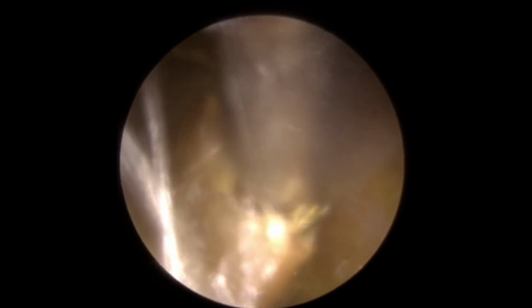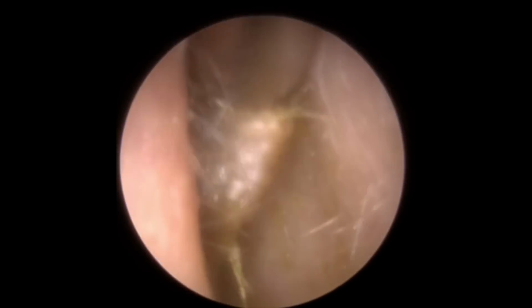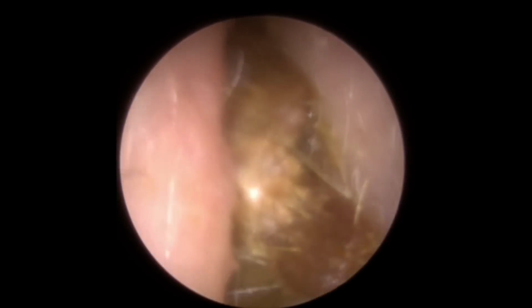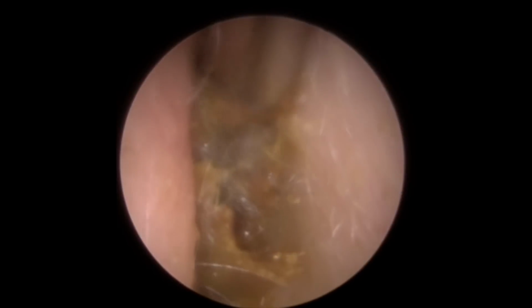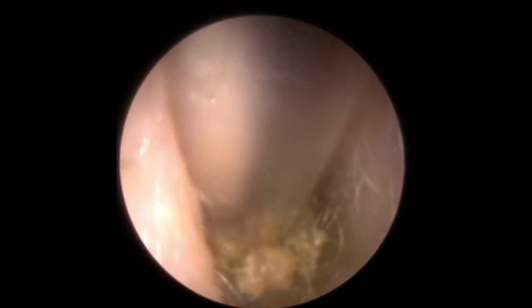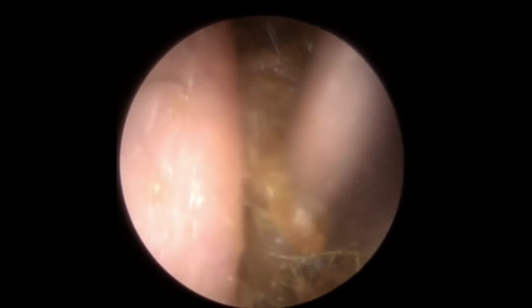What we tend to find with a lot of patients these days, it's such a long wait for the NHS here in the UK, certainly in this area anyway, to get wax removed by suction, that a lot of patients are resorting to using a lot of olive oil to try and soften this up, and lots of lotions and potions. A lot of the time that will actually over moisturize the canal wall, and you get these long strips of skin starting to detach.